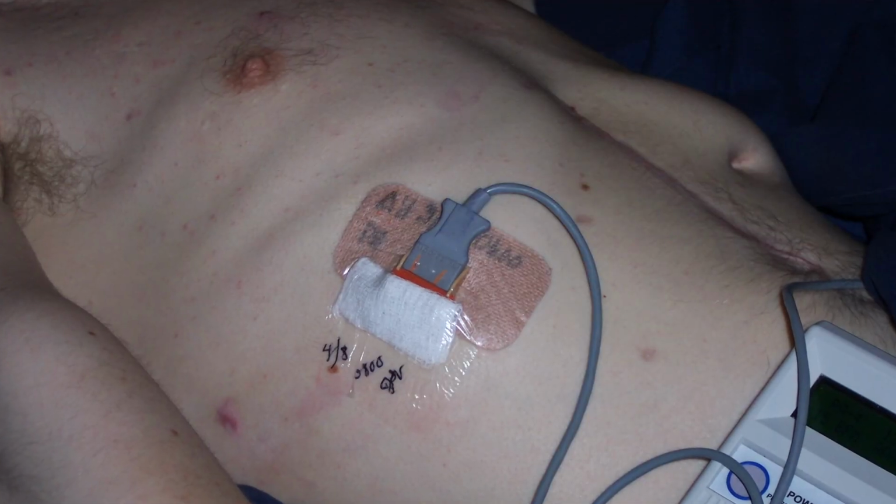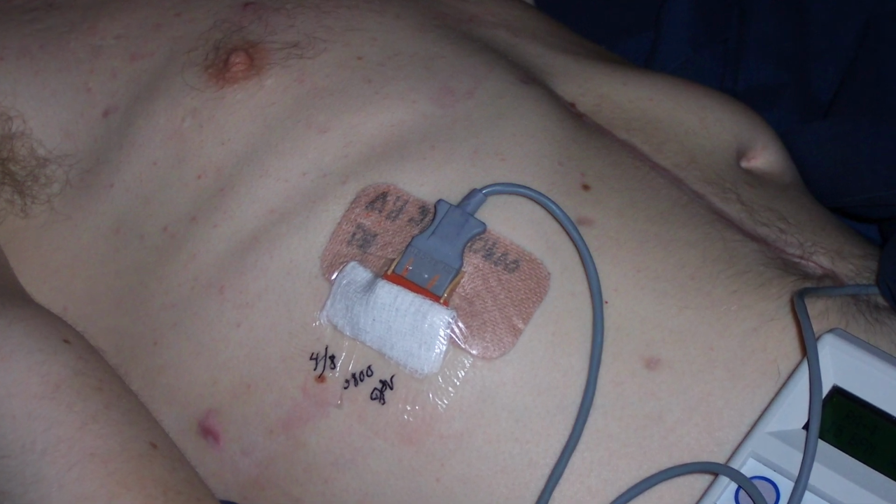But in late 2010, I got what's called a diaphragmatic pacemaker system. I'll leave a card up here that has a video that's more about it if you're interested. But it basically gives my diaphragm an electric pulse or a shock every 4 seconds, or 15 times a minute. And that is what makes me breathe, whether I'm ready to or not. So when you hear me pause at weird times, that's when I have to take a breath, whether I like it or not.